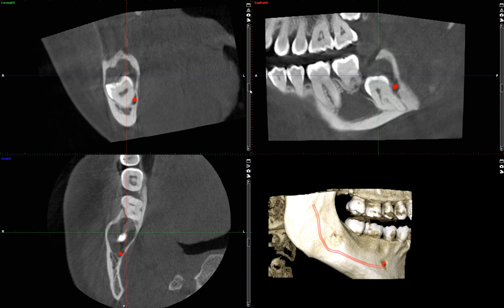I've already traced the mandibular canal. Visualization of the mandibular canal is very essential when dealing with an impacted third molar or any pathology in the third molar area. Because if you ever had to remove a third molar or a cystic or tumoral lesion, you want to know the exact location of the mandibular canal, or inferior alveolar nerve, for obvious reasons.